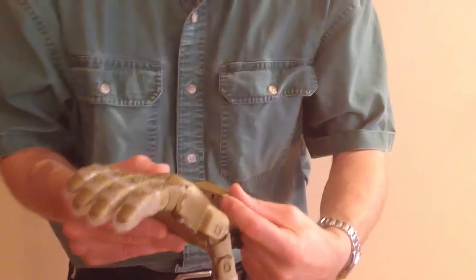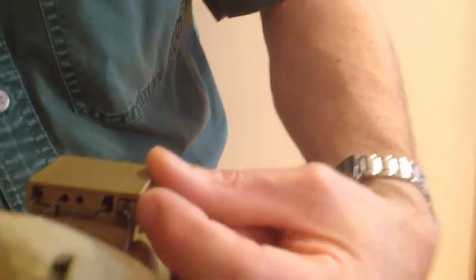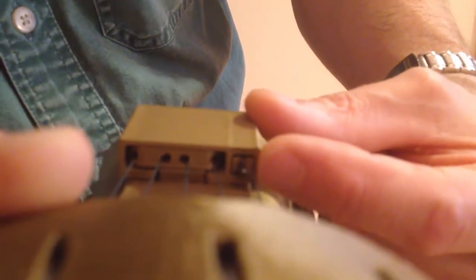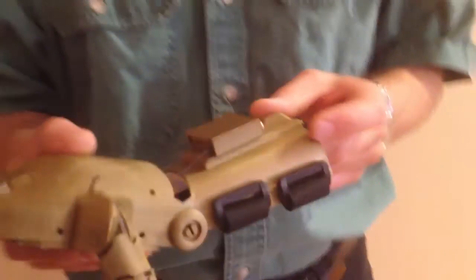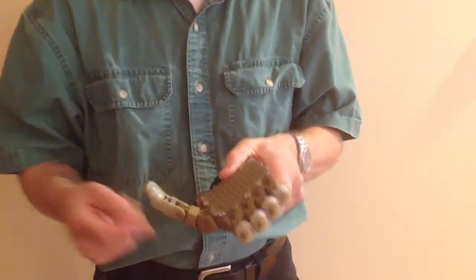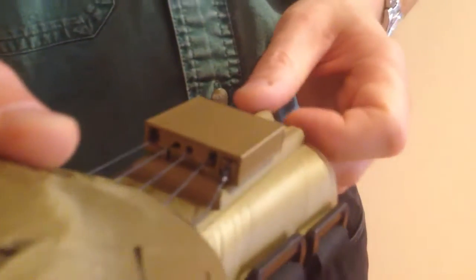The thumb tensioner pin ideally should also be in alignment with the front of the gripper box. It doesn't matter if it's a little bit forward or a little bit back of the front, but not too far because then you're losing the amount of adjustability. You want to make sure that the six knots — that's a knot on each fingertip and thumb tip, and the knot on the thumb tensioner pin — are neat, tied strongly, and have been sealed with glue, preferably cyanoacrylate or CA glue, such as super glue.